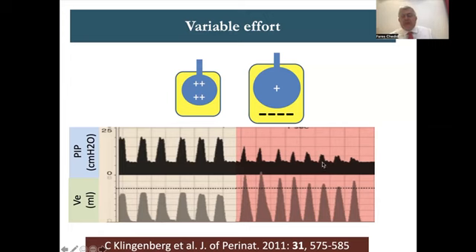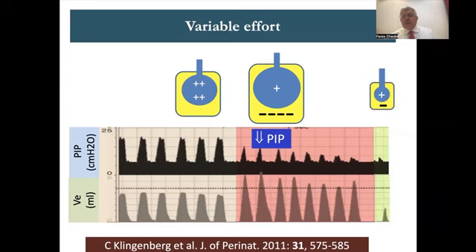Till the patient here, in this place, started breathing slightly above the VG, so his graph returned, no more dumping in this 1, 2, 3. The last 3 breaths, he's not triangular anymore because he's not dumping his pressure, but he's still going down in pressure because the volume is higher than the volume guarantee. Till at some stage, the patient took a volume equal to the volume guarantee. But what happens after, he decided to take no effort at all, while the machine already wasn't giving him any effort because of before. So now the patient is doing no effort, and the machine is doing no effort for now, and his volume is very much down.